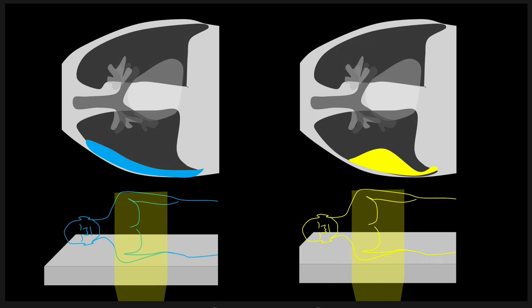So the layering out is the simple one there in the blue, and the complicated one, or the loculated effusion, is the one that's going to maintain that lentiform or bulging appearance. That makes you think that is trapped, right? Otherwise it would layer out and flow freely.